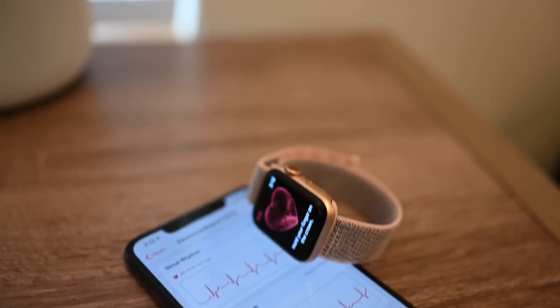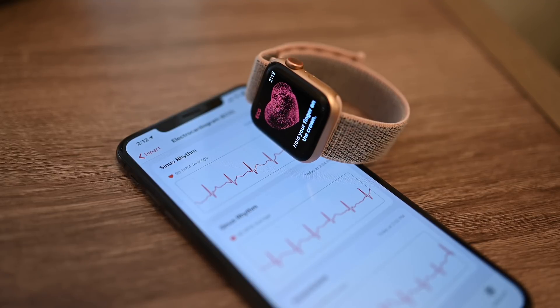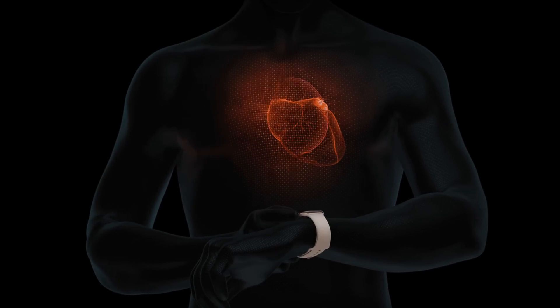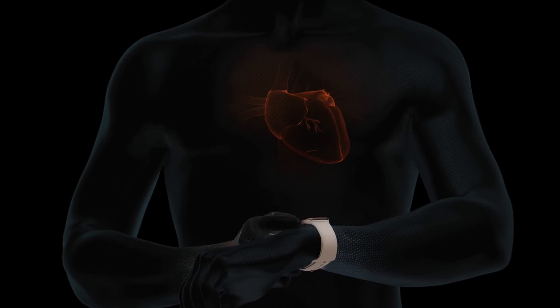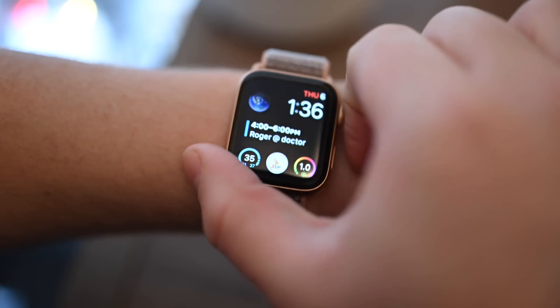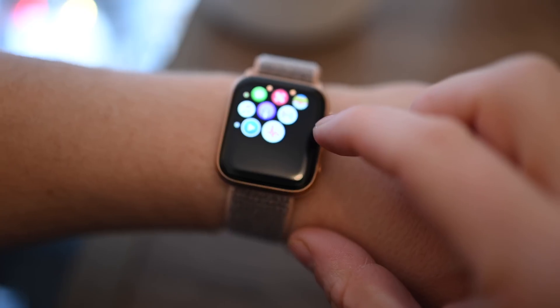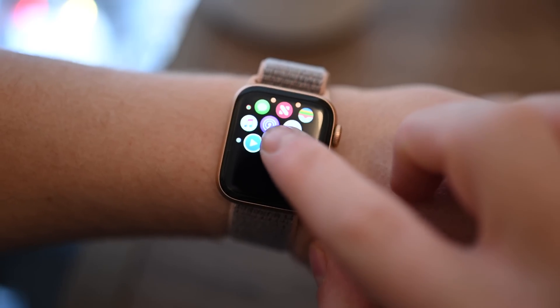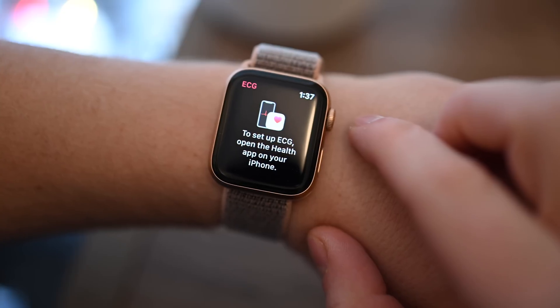We're going hands-on with the new ECG functionality on the Apple Watch Series 4. Welcome everyone, it is Andrew here from Apple Insider. Apple debuted and released the Apple Watch Series 4 without the ECG app, promising it and the functionality to come at a later date. Now that watchOS 5.1.2 update has been released, and with it the ECG app — a separate app from the heart rate app currently on the Apple Watch.